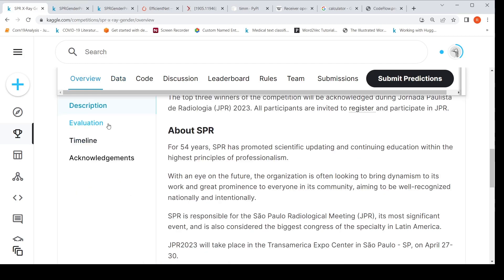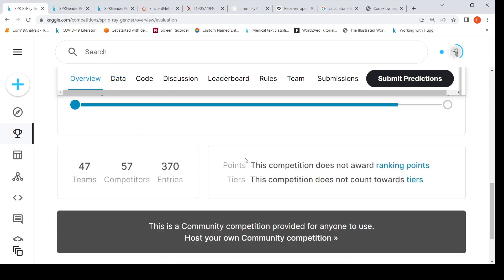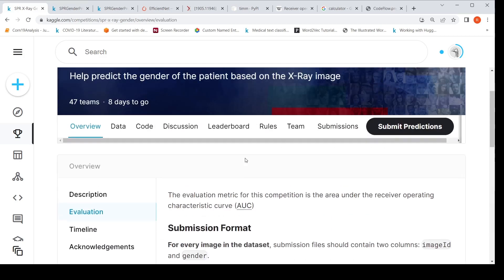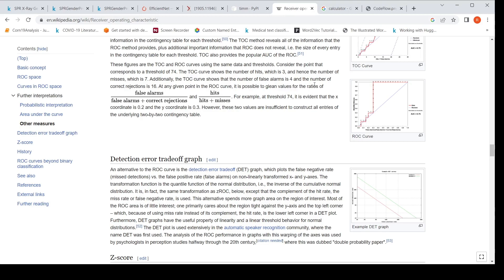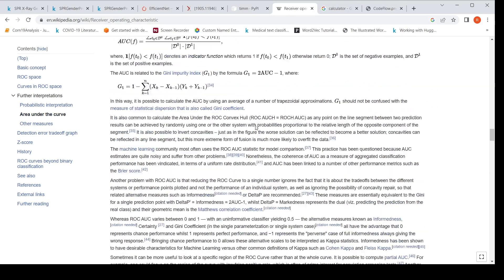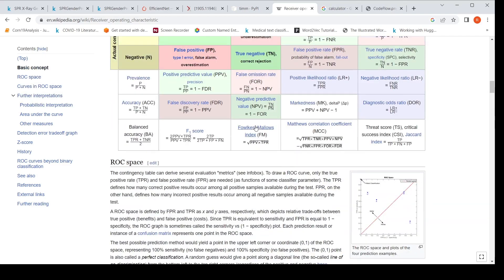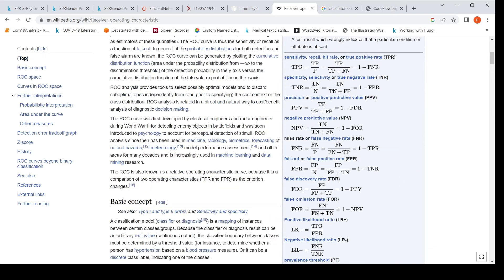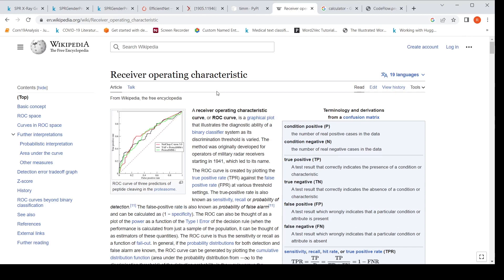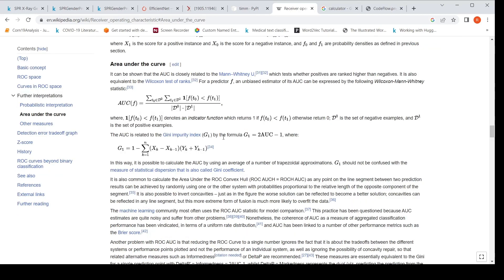Now, how will the solution be evaluated? Your model will be evaluated on the area under ROC curve metric. For more details, I would refer you to the Wikipedia page on ROC — receiver operating characteristics — which explains the area under curve.